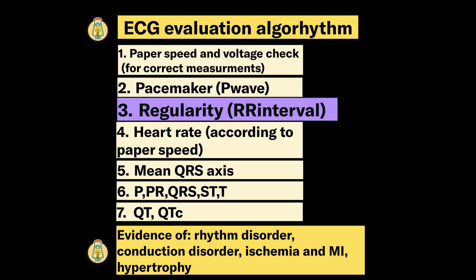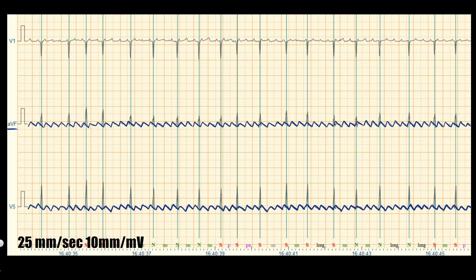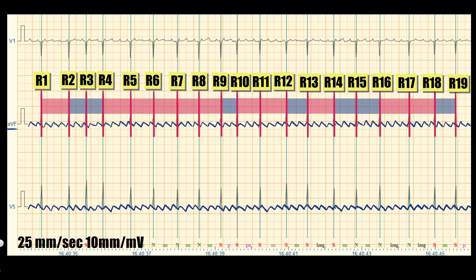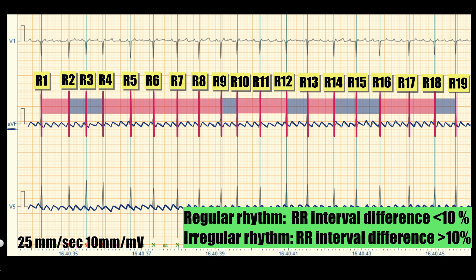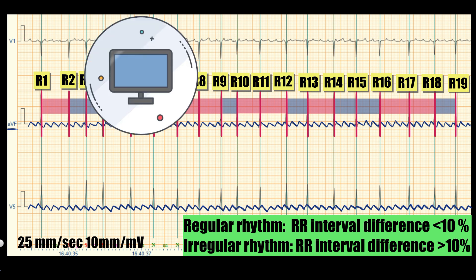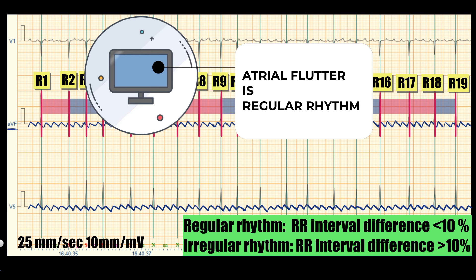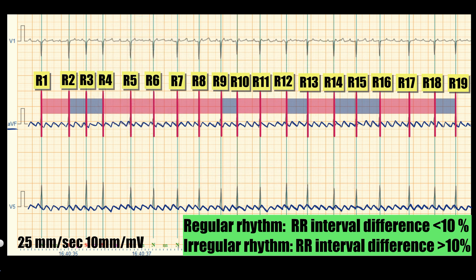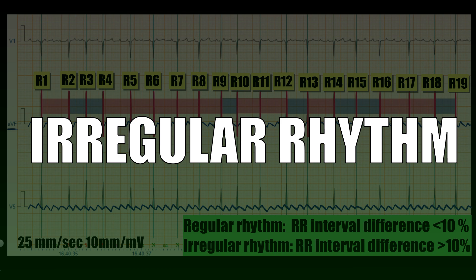The next step is a regularity check. Compare RR intervals to each other, defined as the distances between the peaks of R waves. Rhythm is regular when RR intervals are equal or differ by less than 10%. In some videos, atrial flutter is described as regular, but this is not always true. In our example, even by eye the RR intervals are different, and the difference is much more than 10%, so our rhythm is irregular.